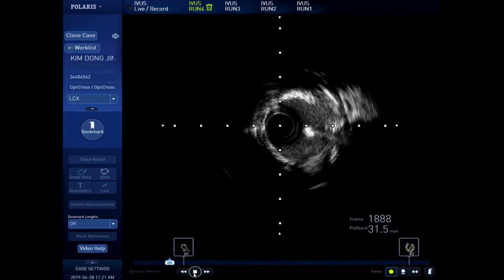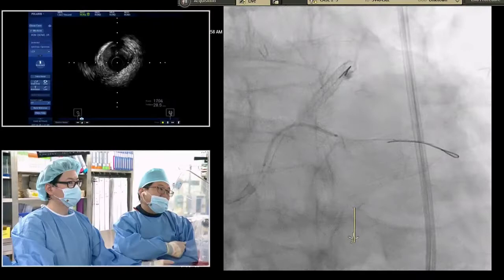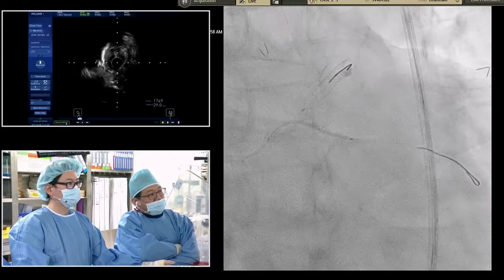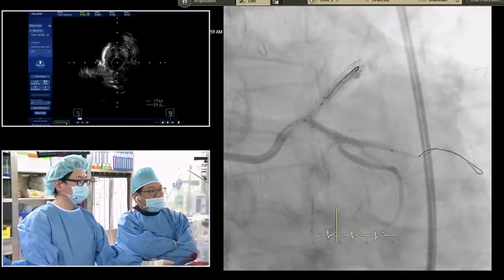So what you've done next is not easy, passing the stent like this. Because of calcification and tortuosity, how to deal with this situation? Next, you can see the LAD balloon and balloon inflation. This is a balloon anchoring technique. Fortunately, there is a stent in the LAD, so I can inflate the balloon. So I can successfully insert a stent to the circumflex. And I inflate. Next, please.